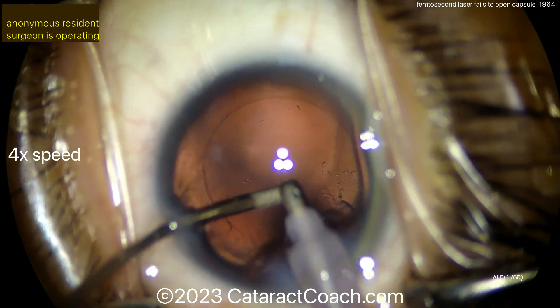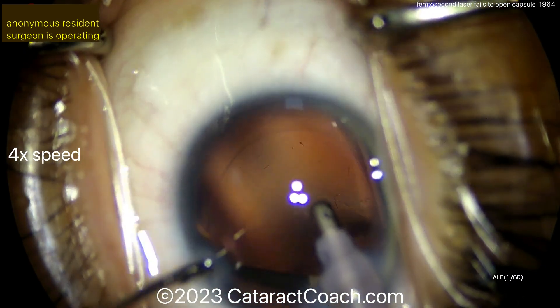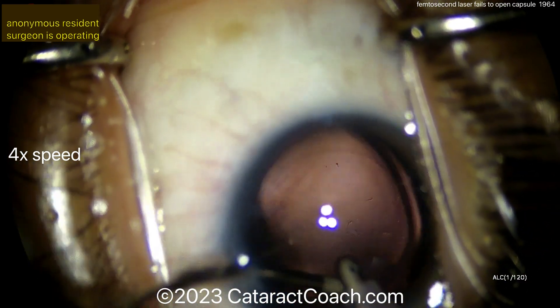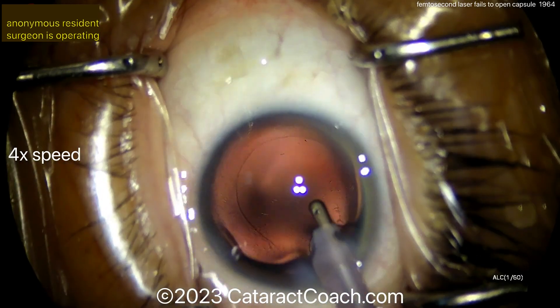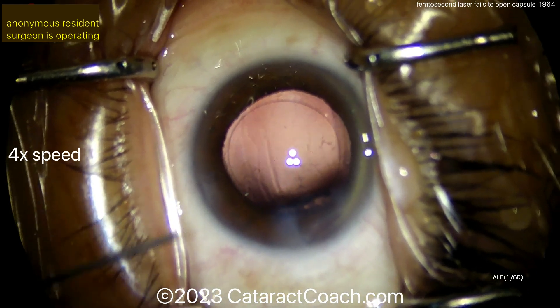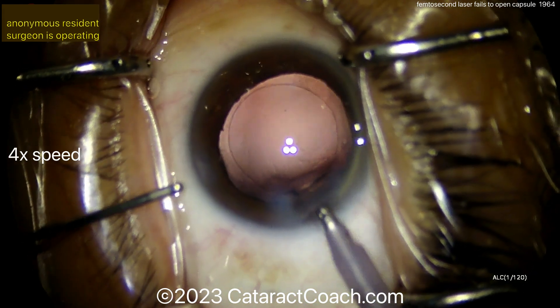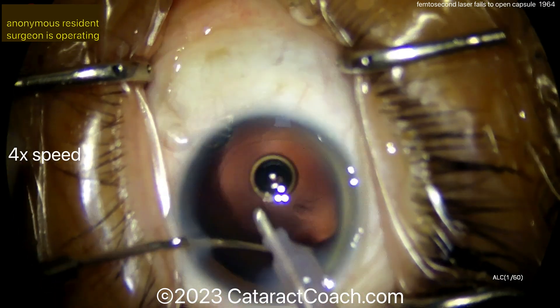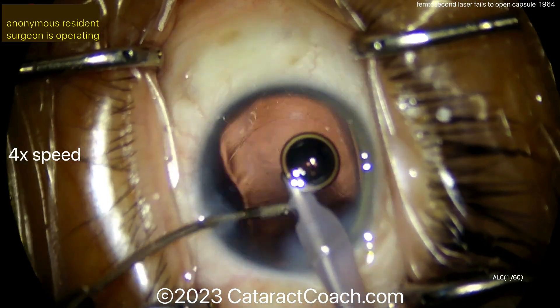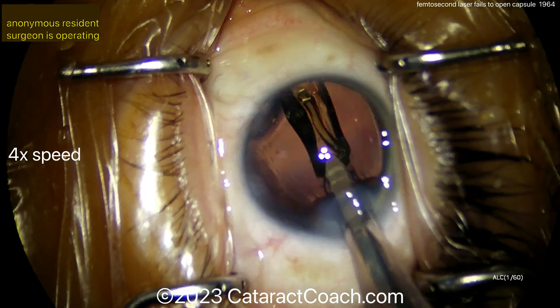I don't think that sub-incisional material has been removed — there's a significant degree of it. Try to get it out, maybe after you put the lens in, but you don't want to leave that in the eye. Now filling up the bag with viscoelastic — the rhexis looks very good, capsule looks intact. More IA going in, aspirating again to get that sub-incisional area. A trick you can use: inject viscoelastic through the side port to visco-dissect the cortex off that way.